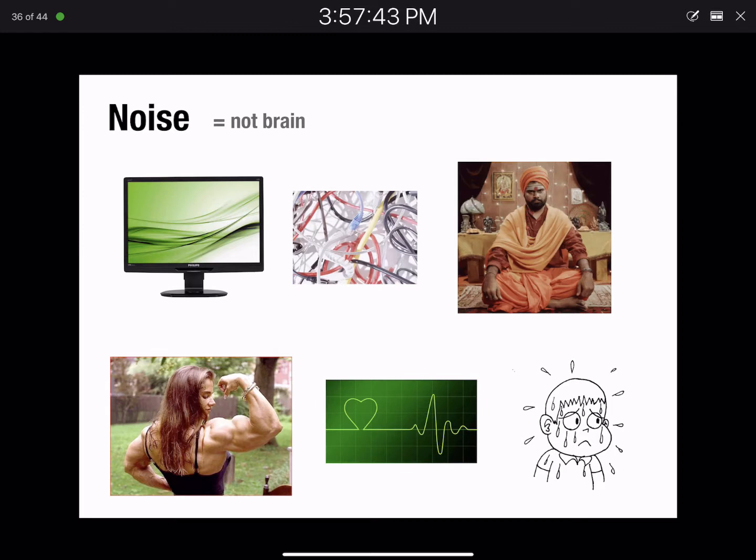And the sweating typically manifests as what we call skin potentials, which are these very slowly changing drifts over time. So your ongoing EEG is sort of this rapidly changing stuff.